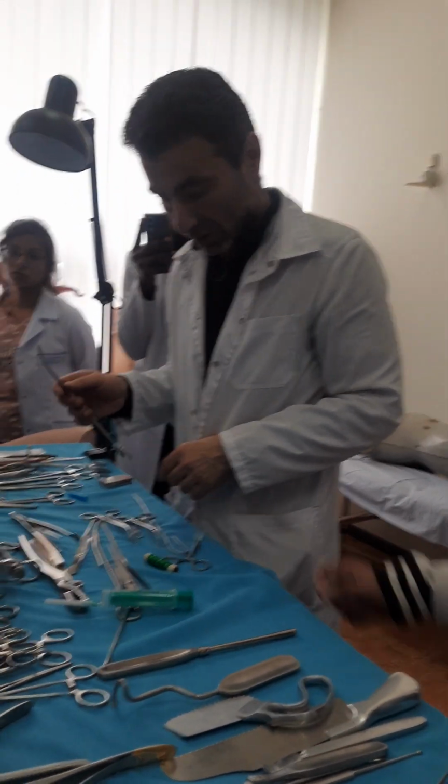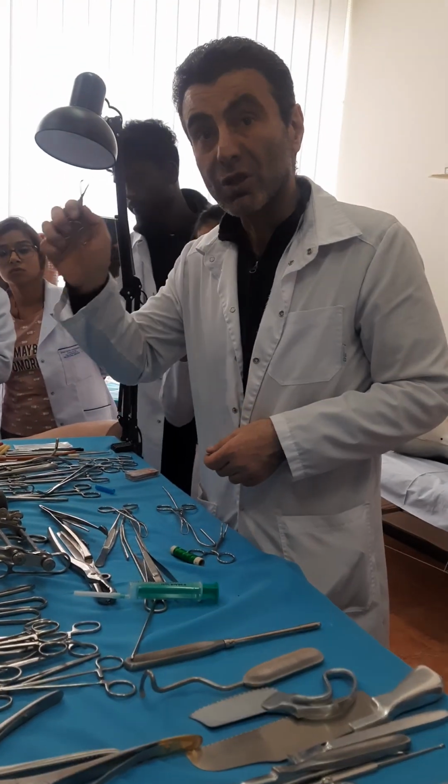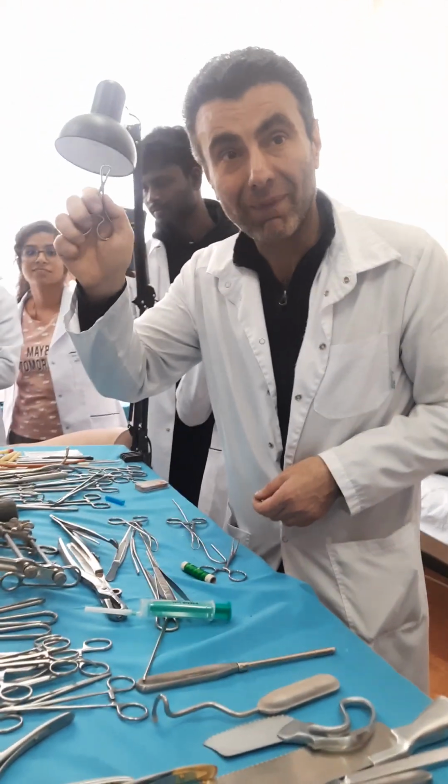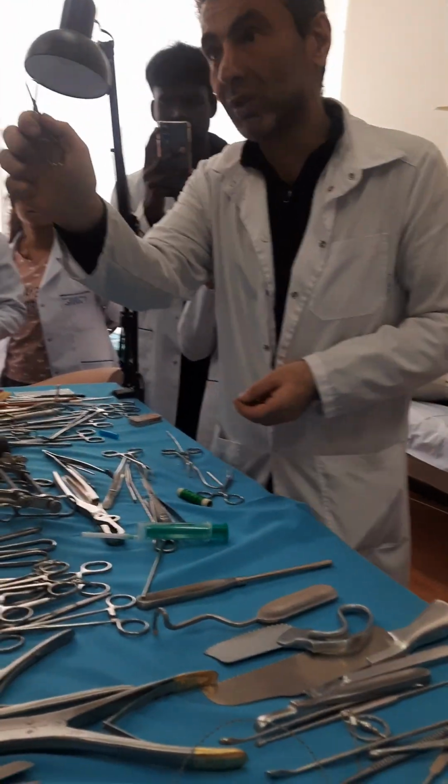What is the small one then? This is also for covering. Oh, okay, great question. This is a small towel clip. The action is the same, but it's small.